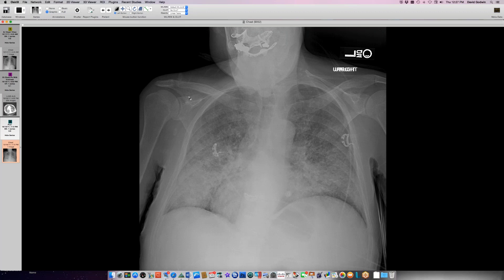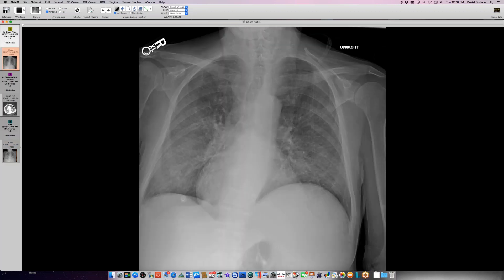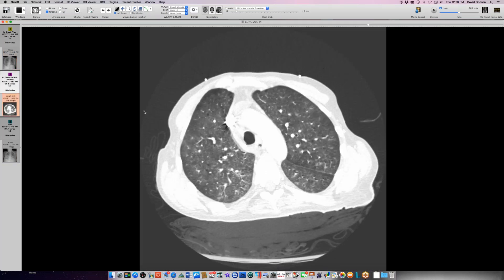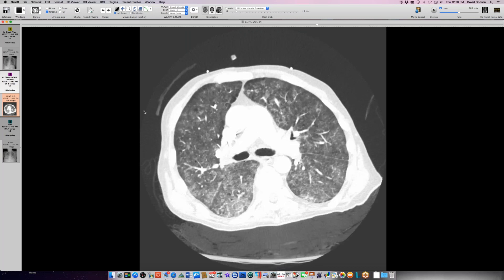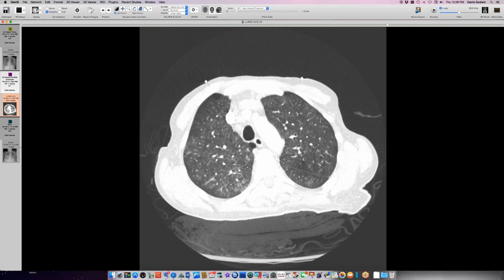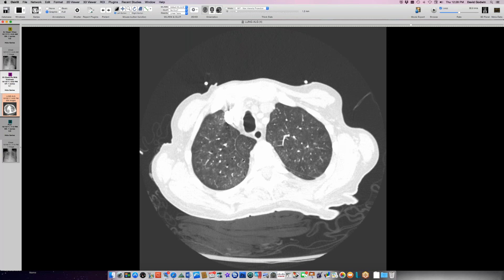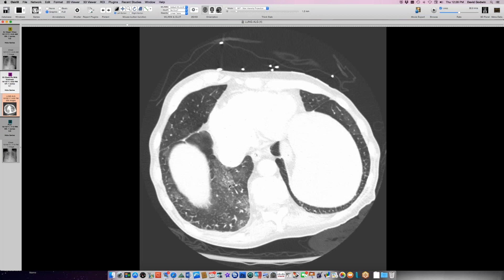This is a case of a person who was receiving a platelet transfusion and became short of breath, tachypneic, and mildly febrile as the platelet infusion was finishing. Then had this chest radiograph taken shortly thereafter. Things cleared fairly rapidly — a day later you can see a lot of clearing of this diffuse lung disease. On CT, this is widespread ground glass abnormality, somewhat basal predominant but really everywhere, with some septal lines indicating an edema component. There's also an interesting accessory fissure with no azygous vein in it. This is transfusion-related acute lung injury — a capillary leak generated by platelet transfusion.